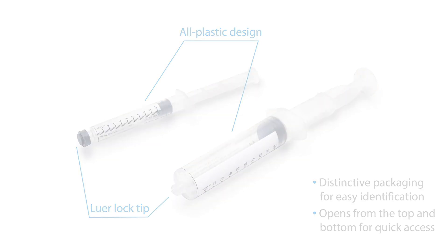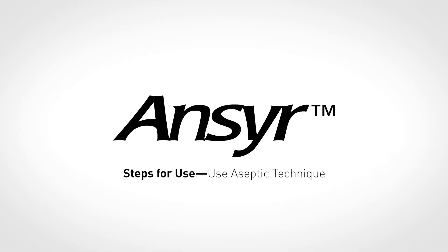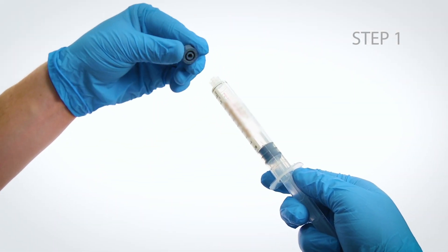Let's review the steps for use for the Answer syringe. Use aseptic technique. Step 1: Remove the Luer lock cover.